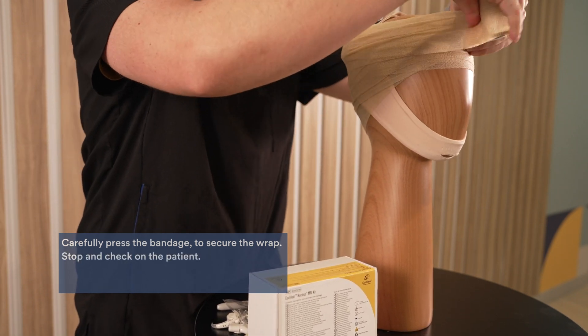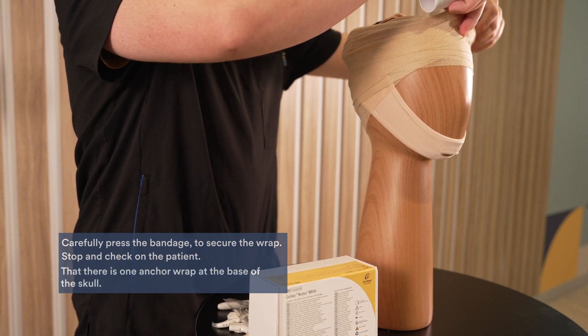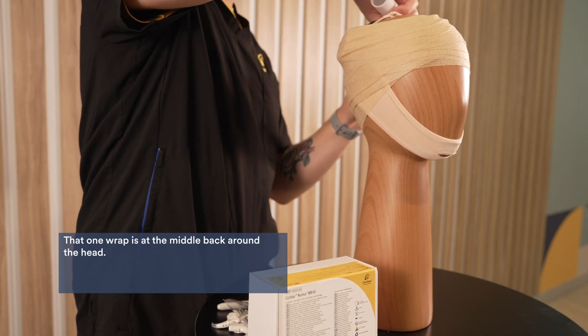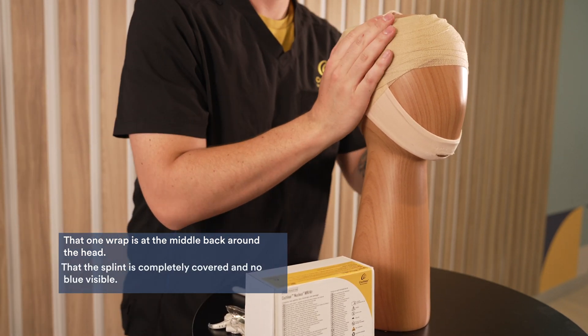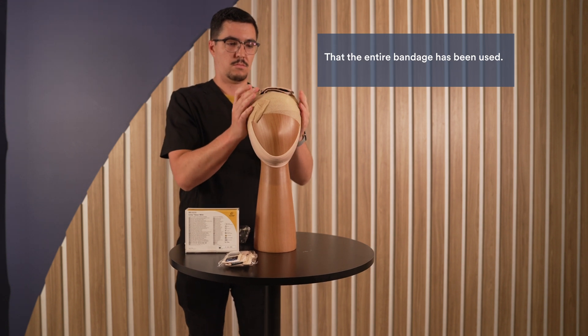Stop and check that the patient is comfortable, that there is one anchor wrap at the base of the skull, that one wrap is around the middle back of the head, that the splint is completely covered and no blue is visible, and that the entire bandage has been used.